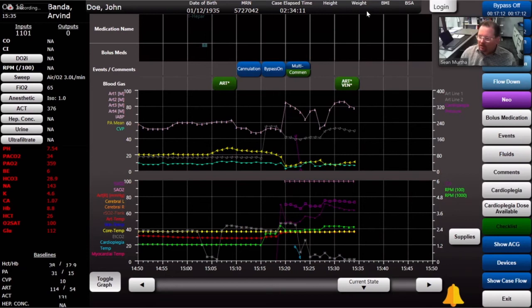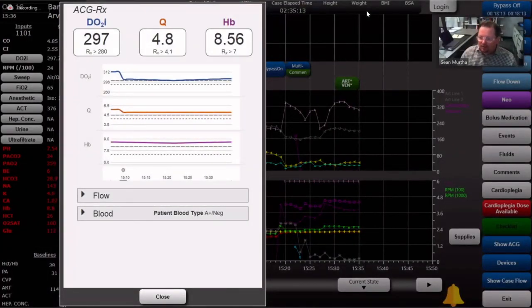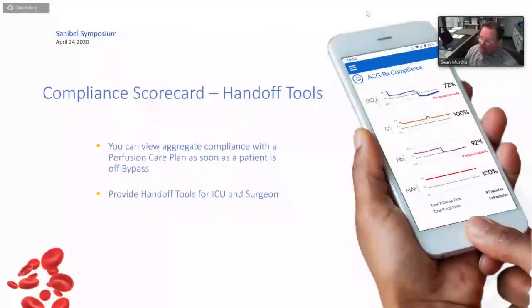So you can see representative different trends. And then send it into your pre-incision brief, into your cockpit, and you'll be able to monitor the case from what you've actually done and whether you are compliant with your care plan from the pre-incision brief. And then ultimately at the end, measure it. How did I do? Can you aggregate those kinds of things, and then turn that into reportable handoff tools for the ICU and for the surgeon, saying I had an issue in the case?